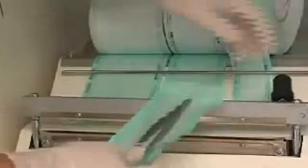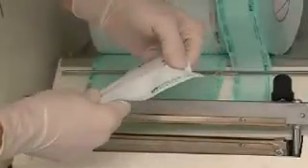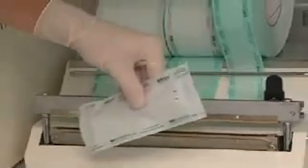Sometimes the instruments are shrink-wrapped in a special paper foil that allows for short-term sterile storage of the instruments. However, the package cannot be damaged or the instrument immediately becomes non-sterile. Sterile instruments are useless if non-sterile covers are used. There are different options in terms of sterile covers.